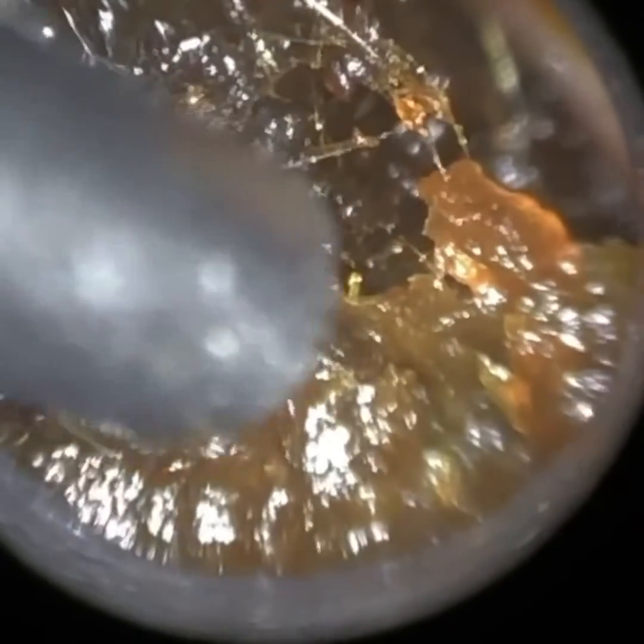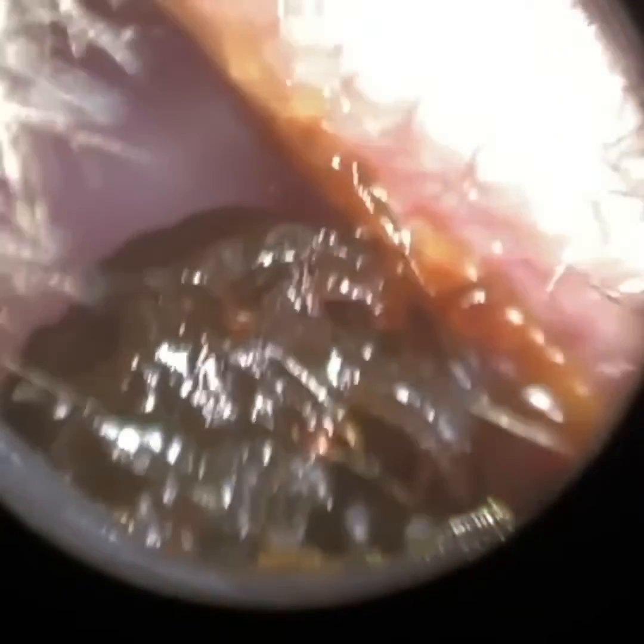We're just using our 5mm speculae here. There are going to be three other sizes: one larger 5.7mm and two smaller ones at 3.5mm and 4.25mm. With this patient we're able to use the 5mm, and we're just using the speculum to dilate open the ear canal.